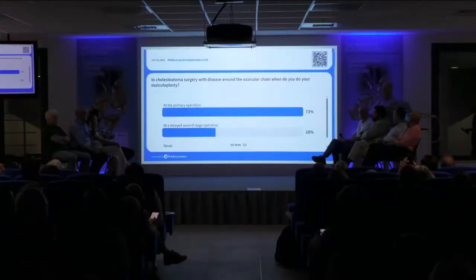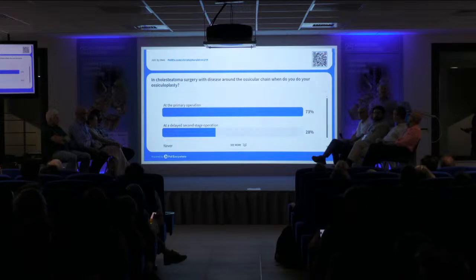So let's just say we're doing... Do all the panel do canal wall up surgery? No, do you always do canal wall down? Always, okay. But for those who do canal wall up surgery, can I just ask you, do you all plan a second stage operation? No, okay. So quite a lot of us are going to primary obliteration and MRI follow-up and not doing a second stage.